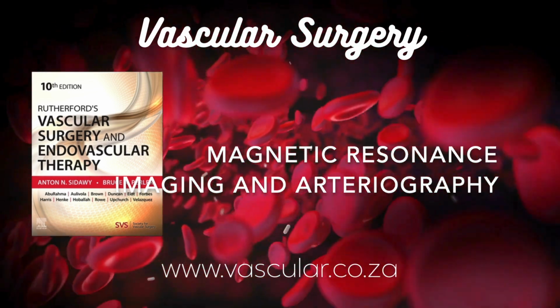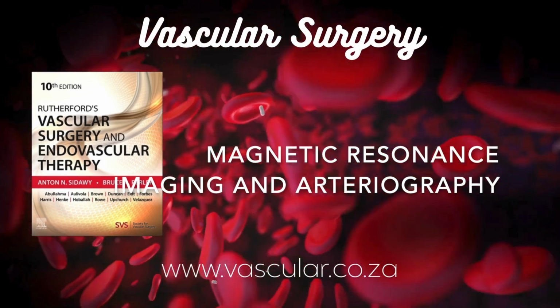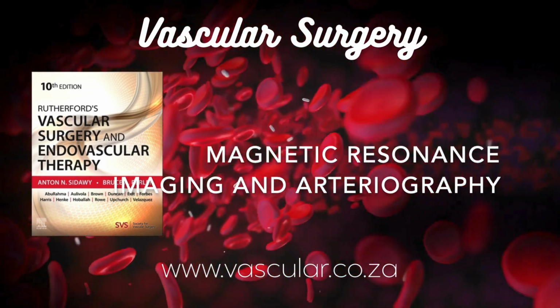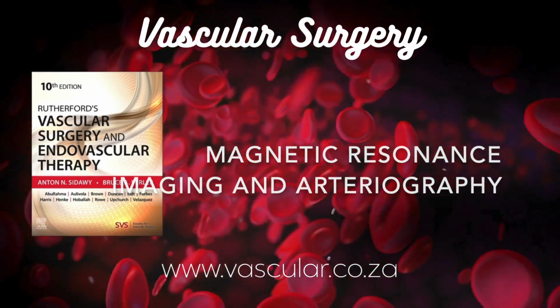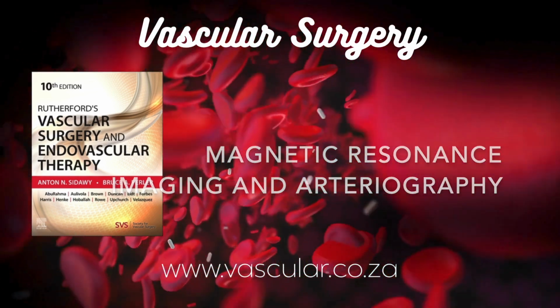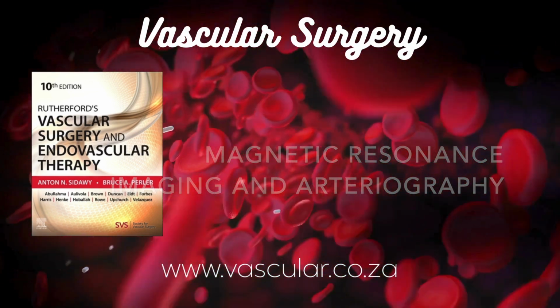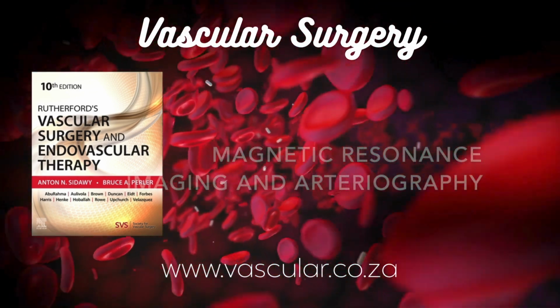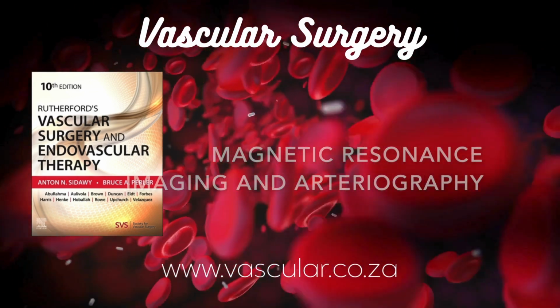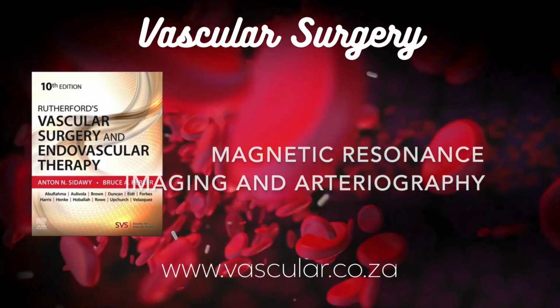So this super strong external magnet, what's the first thing it actually does? Okay, so it causes the protons within your body's tissues, primarily in water molecules, to align. You can kind of picture these protons as tiny spinning magnets. Right. Normally, they're all pointing in random directions, but when you put them in a strong magnetic field, they tend to line up with that field. And the strength of this external field determines the specific frequency, the resonance frequency, at which these protons will respond to the RF pulses we send in.